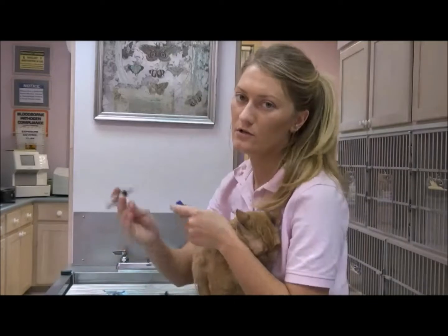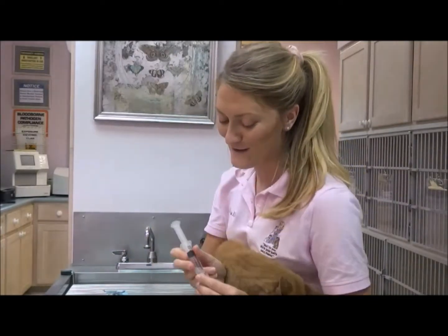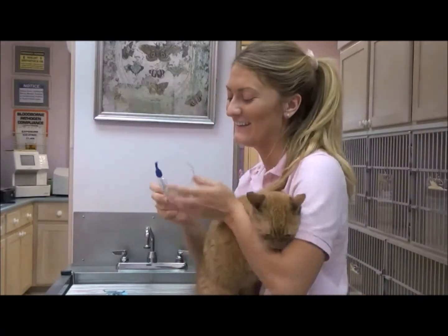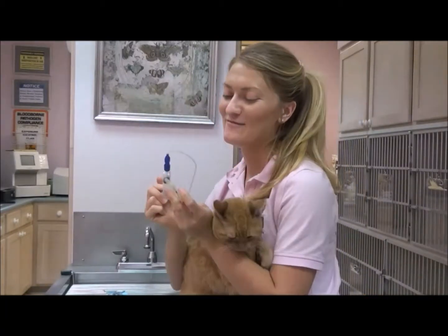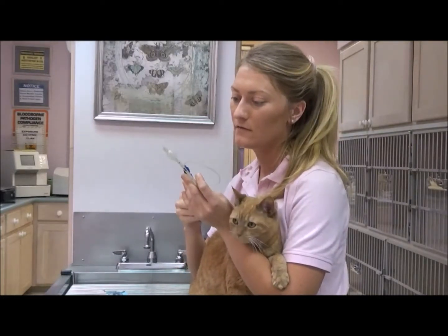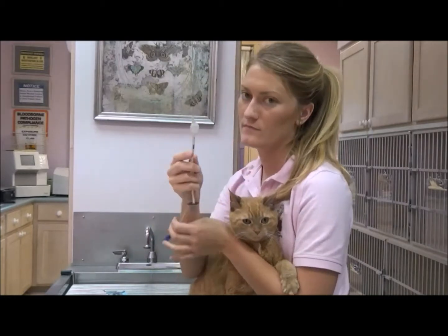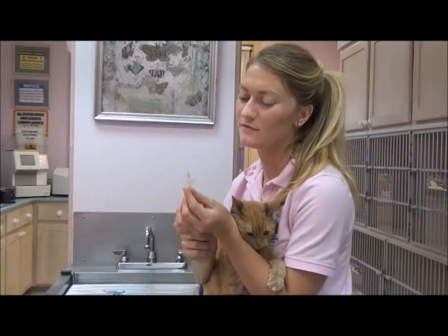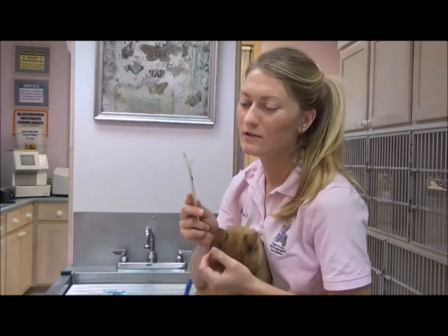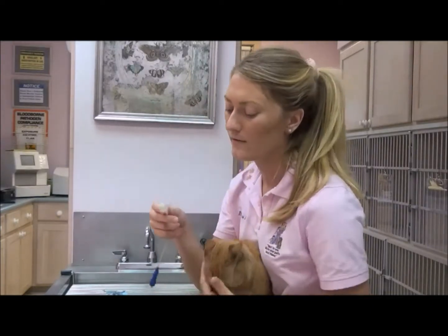Another key thing you want to do is make sure that you use a puffer cuffer here to inflate the cuff indicator. So you inflate that, make sure that the cuff inflates properly and that it retains its shape once you inflate it. But the best way to make sure there's no leaks would be to put this in a dish of water and just check and see if there are any air bubbles that come about.